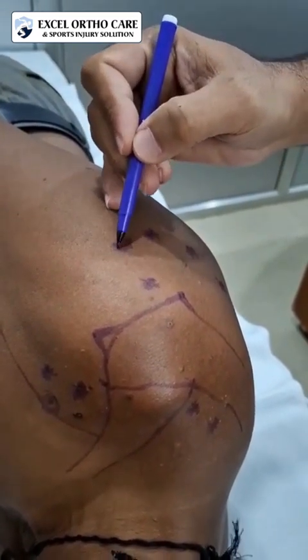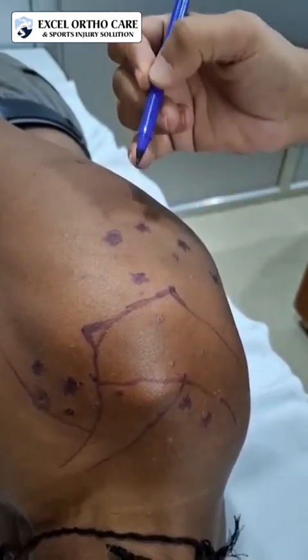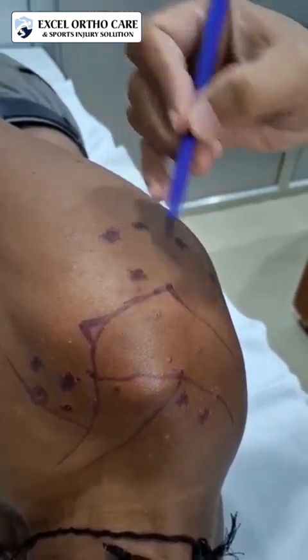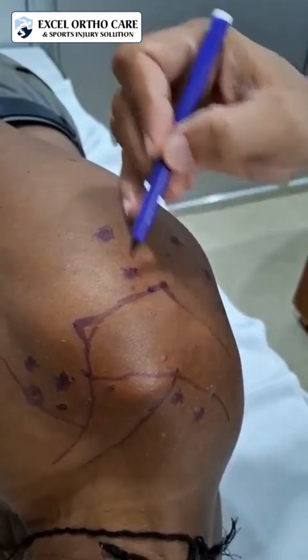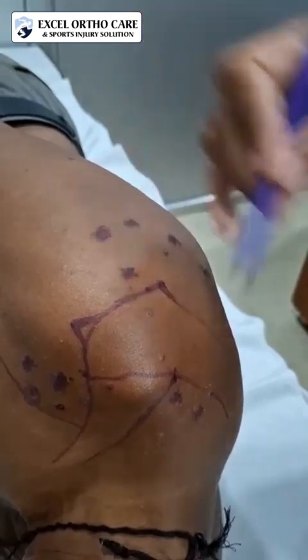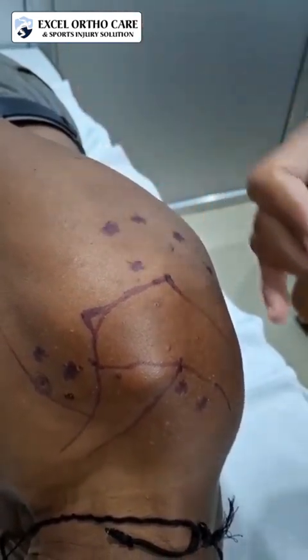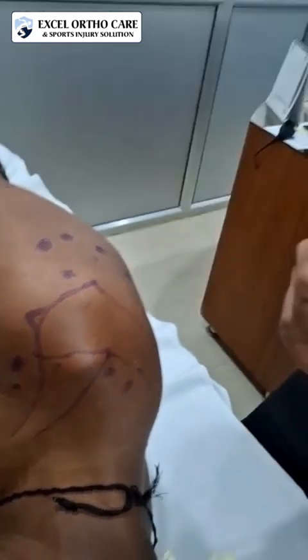The next portal is the lateral portal. Lateral portal is 3 centimeter lateral to the edge of the acromion, 3 centimeter anterior, and at the level of the clavicle. This portal is basically the instrumentation portal and it is used in the subacromial decompression and the rotator cuff repair.